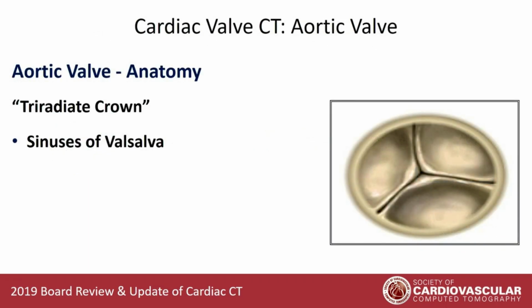Okay, so this is kind of our granddaddy, right? This is the first valve that we look at and think about. This is where most of the work is. This is where most of the studies are. It's honestly where most of the volume is in our practice. We do about 5 TAVR CTs a day. It's not a fun day, honestly. The TAVR CTs, as you know, take a long, long time to perform. But if we would open the floodgates, right, I'm confident we could do twice as much volume in this area. This is a major source of volume looking at the aortic valve for us, and we'll hear more from Dr. Lee coming up on that.